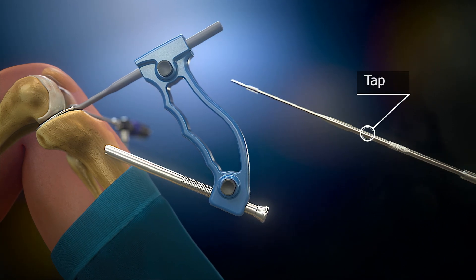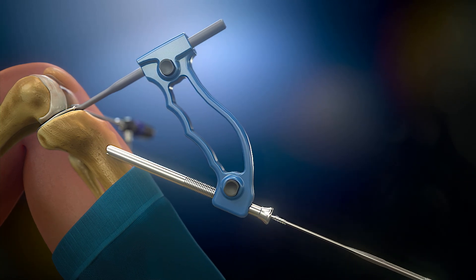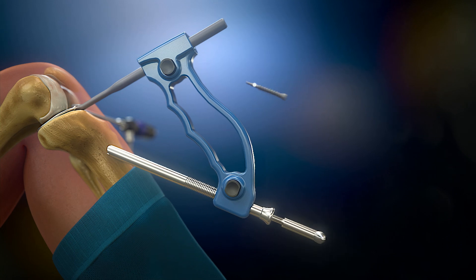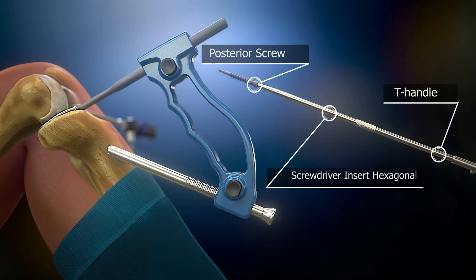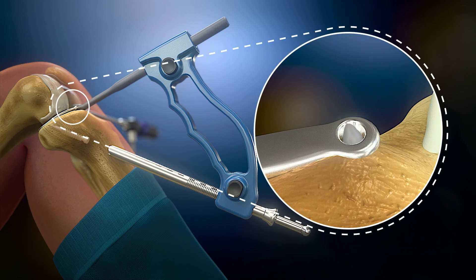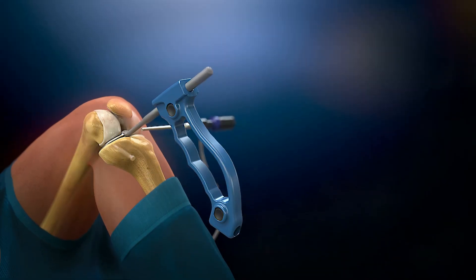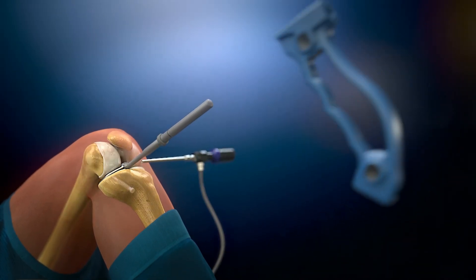The tap is used through the trophine. The screw with the right size is connected to the T-handle and inserted into the tibia until the neck of the screw is fully visible. After placing the first screw, the trophine and the aiming device are removed.